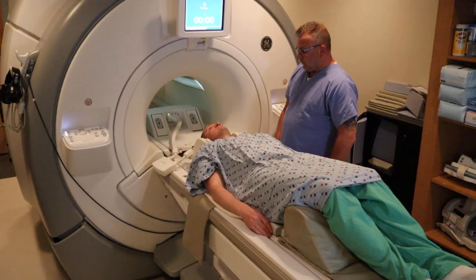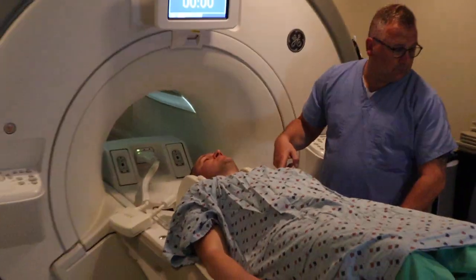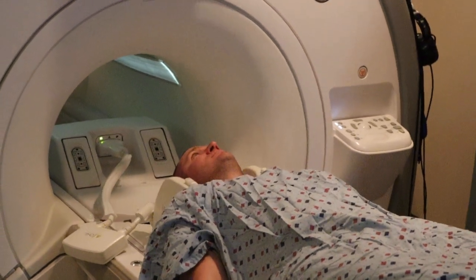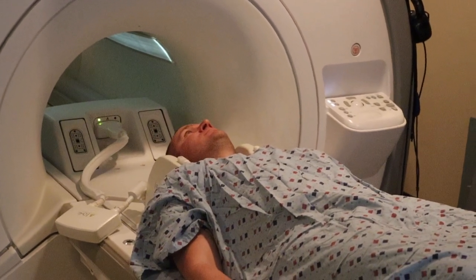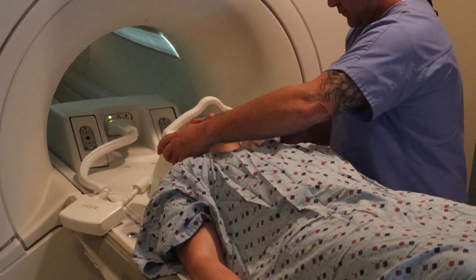You're going to have the shoulders pressed right against the cervical spine coil, which is right next to his head as you can see. You want the head to remain nice and straight with no left or right tilt.